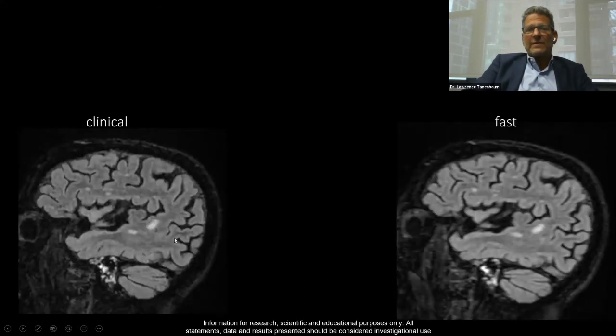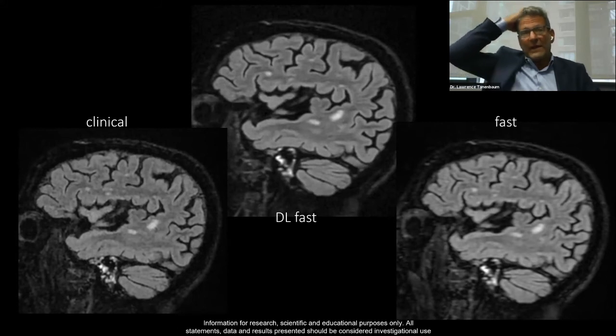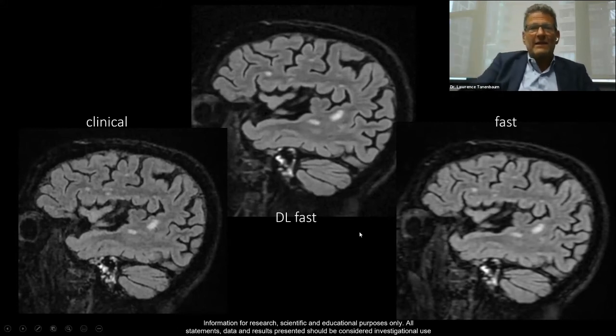Again, same dilemma. This is a clinical standard of care scan. This is what we accelerated to for a variety of purposes. Notice the SNR is very high. The contrast to noise is actually very high, but the spatial resolution is lacking. Notice what a deep learning network can do for this in terms of sharpening up the image, still maintaining the low contrast detectability, the contrast resolution. I think it's really exciting stuff.